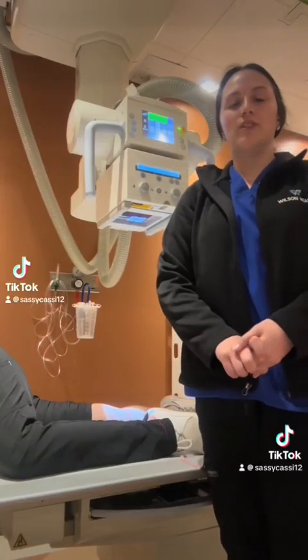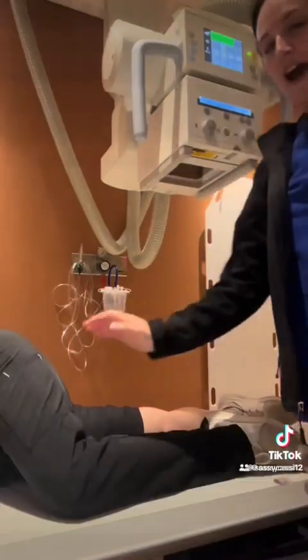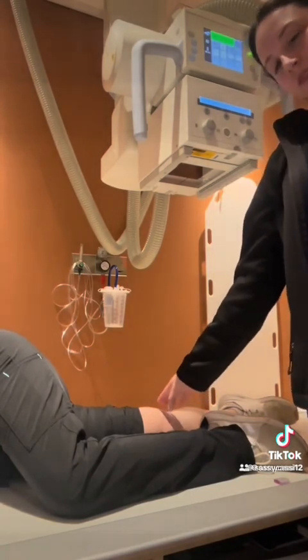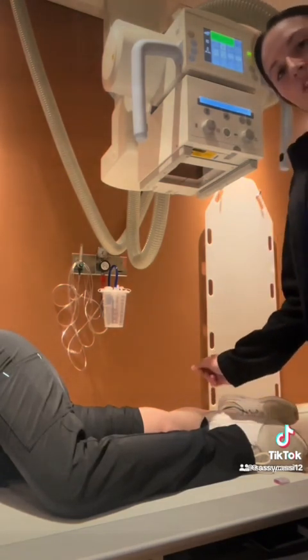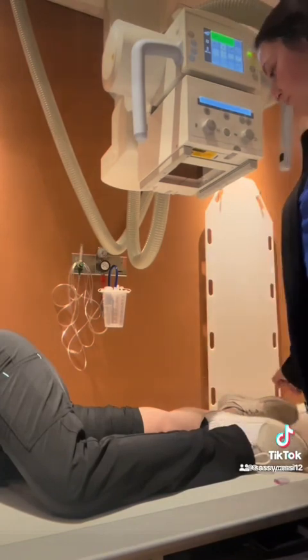Now we're going to go to the lateral knee, and I asked Shelby to roll onto her side. I have Shelby bring this knee over to make it a little bit more comfortable for her and make sure that the epicondyles of the knee are superimposed and not rotated. And I also make sure that her knee is flexed 20 to 30 degrees to show the best image.